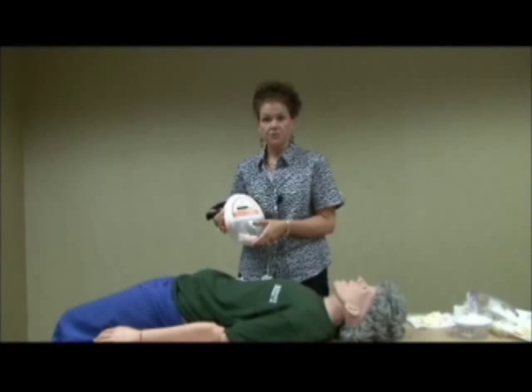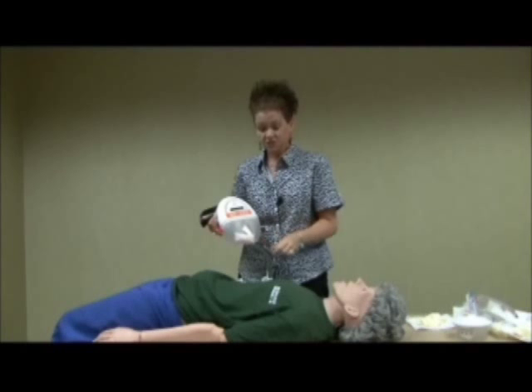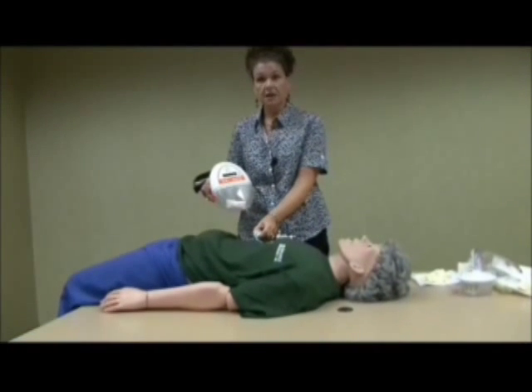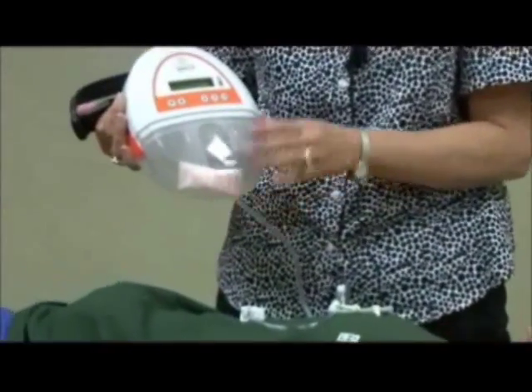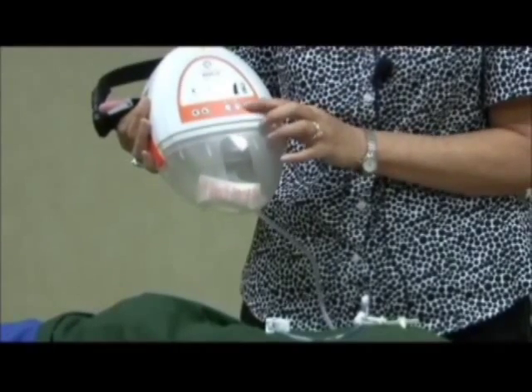Should your negative pressure machine read high vacuum alarm, you'll need to check all of the connection points to make sure that everything is unclamped. Once you resolve your high vacuum alarm, you'll want to push the go button, the furthest button to the right, to restart your machine.